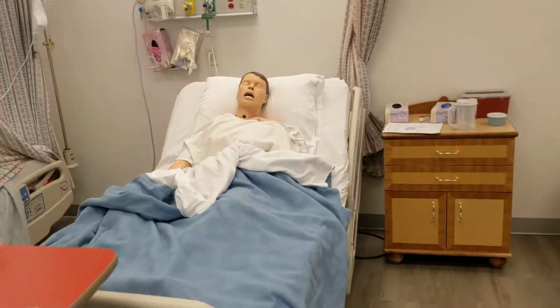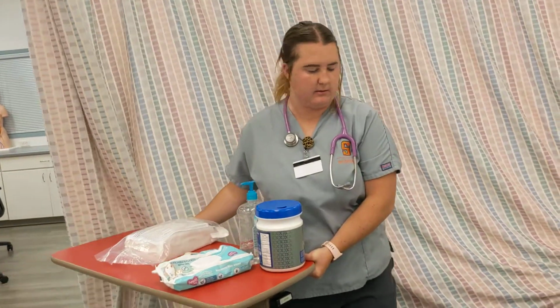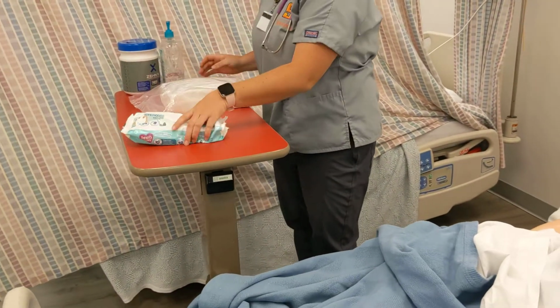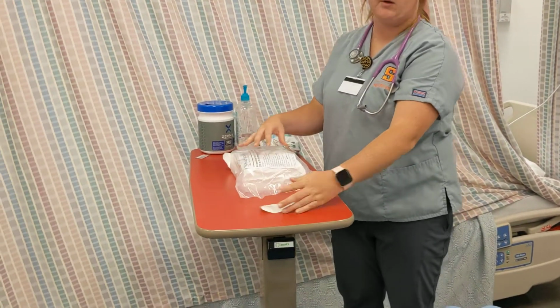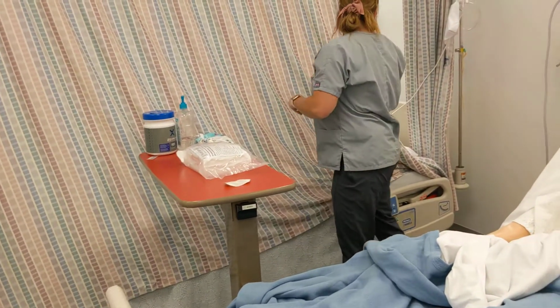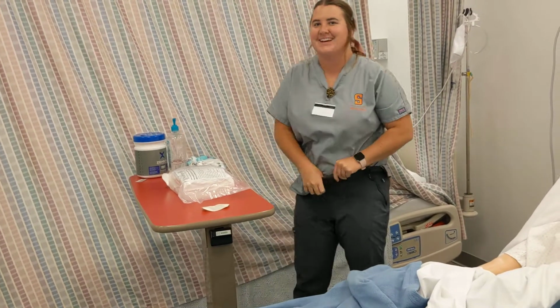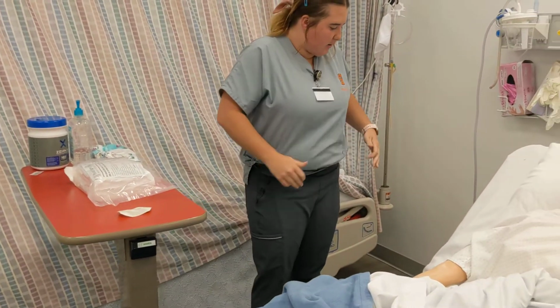Now I'm just going to set up over here so I'm able to be close to the patient with all of my things I need. Just gonna move our things so that we have space. Okay, so first off, I'm gonna take off anything that could possibly get in the way and put it over here on my other desk. Actually, I'm gonna tuck my shirt in a little bit because I feel like that could touch the patient and make it non-sterile. So we are ready.